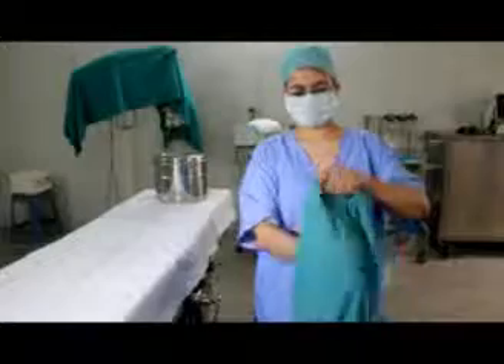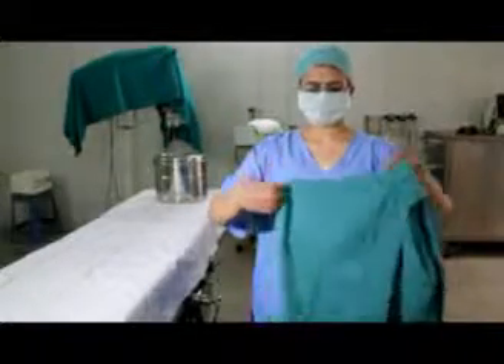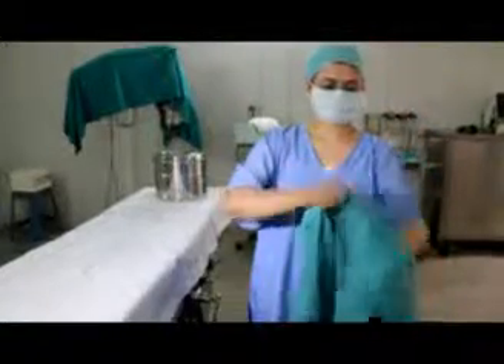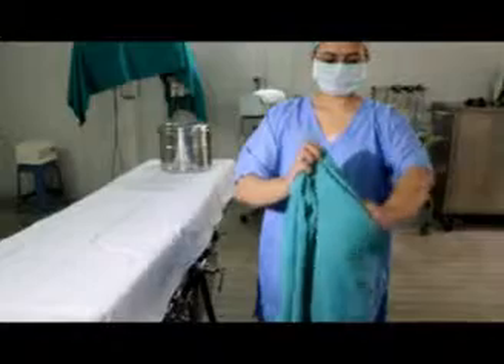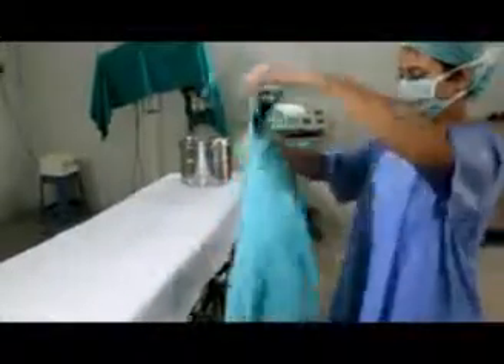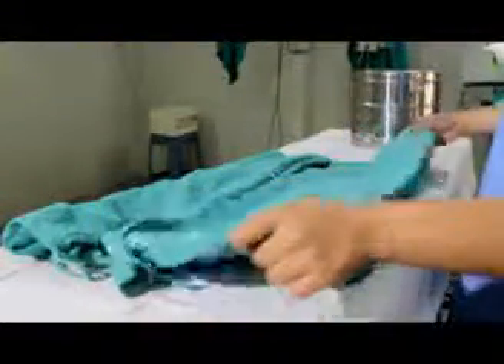Turn the gown to be folded inside out. Now fold the gown sideways and remove the collar cords out. Now placing this gown onto a table, fold it sideways as shown.